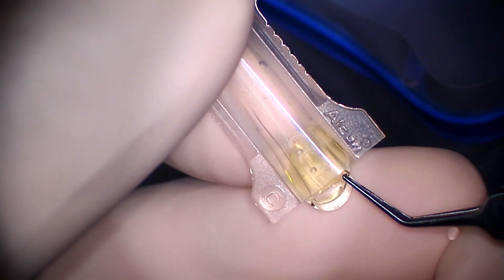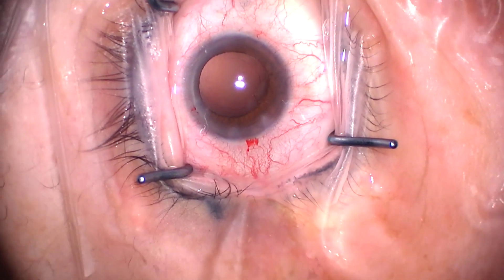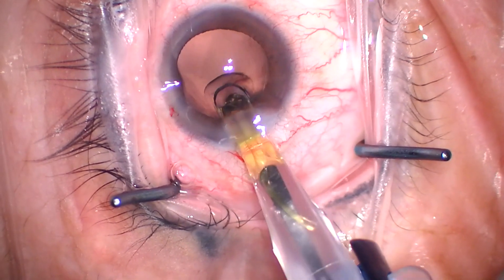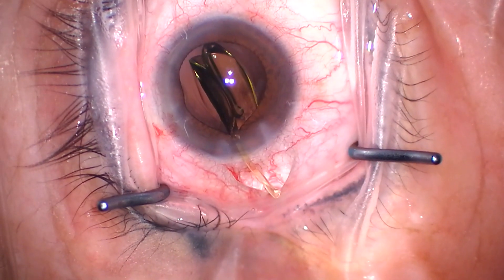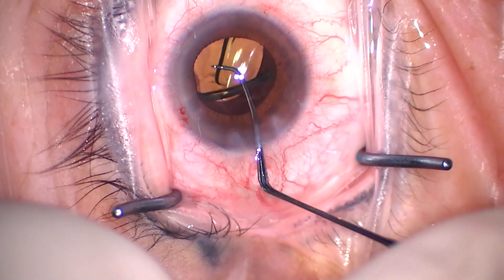Here's the process using a C cartridge: the IOL goes inside, the leading haptic is folded over, and there's the trailing haptic. We advance this down the plunger and as we do, you'll notice that trailing haptic opens up. We can still insert it — let me show you. Back at the eye, we have good draping with all the lashes out of the way. We fixate the eye and get the tip in — this is a C cartridge through a 2.75 millimeter incision, so it fits very easily. We deliver it inside the eye, and we simply use a second instrument or a chopper to position that trailing haptic in the bag as well. We let it open up and everything looks great.